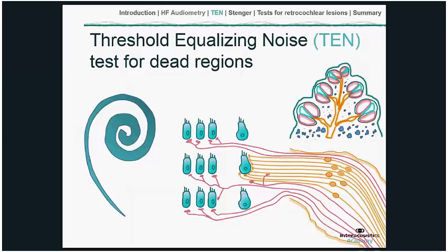So when there is a typical age-related or perhaps noise-induced hearing loss which involves outer hair cell dysfunction, then we might, for example, apply a hearing aid, and the aim of the hearing aid is to mirror the normal job of these dysfunctional outer hair cells in at least providing some degree of amplification, usually in a compressive, non-linear fashion.